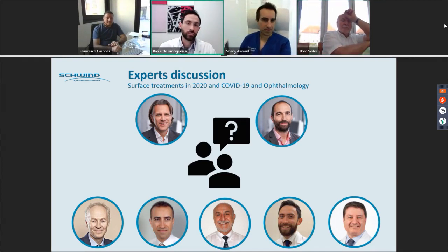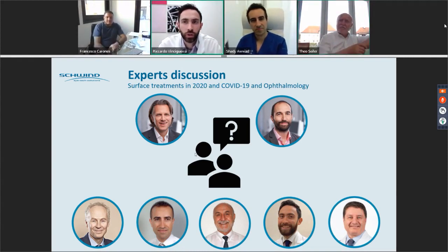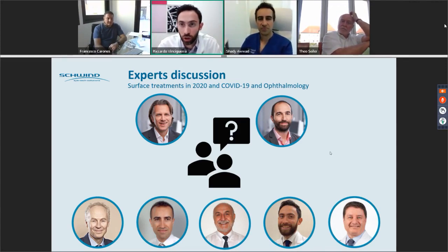In general. Okay. Riccardo, I do have another question. Those drops of 0.15% hyaluronic acid to get a nice new surface, doesn't that have to be standardized? Because if you wait longer, it's gone. The reason why I spoke about the 0.15% is because what we are using had a brand name, LaserVis, but it's not sold anymore. Now we are using one that is made just for us, but is still not available. So the reason I gave the percentage is because it's not available on the market.